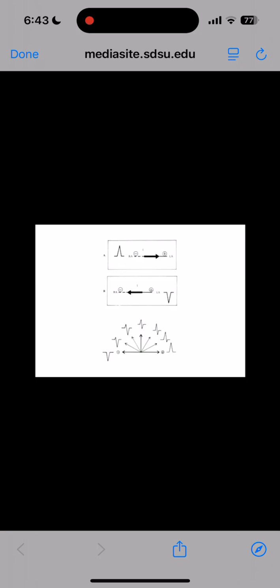What you can see in the lower slide here is that there is a relatively large finite number of different profiles. So as an example, if my lead 2 was here, and if my dipole was like this, perpendicular to it, I would have that middle profile where it would be equally up and equally down. And that's basically because if that lead is going this direction and my dipole was perpendicular to it, that is how it's going to be recorded. So what I'm trying to explain to you is that based on the position of your lead and where the dipoles are placed, that's what gets recorded.